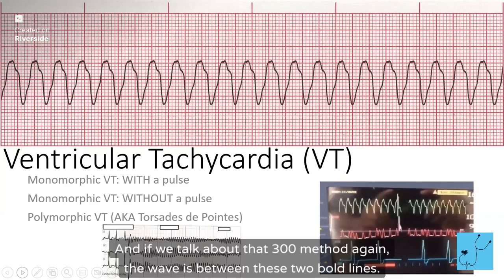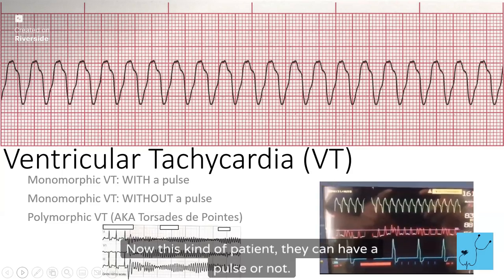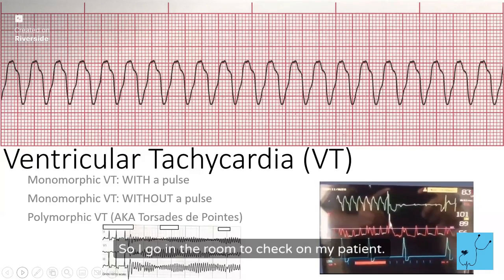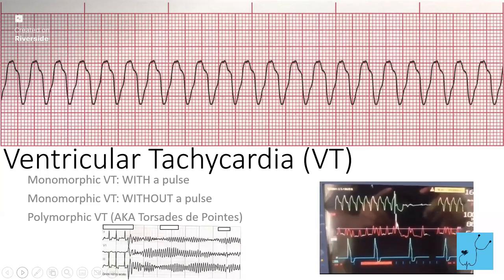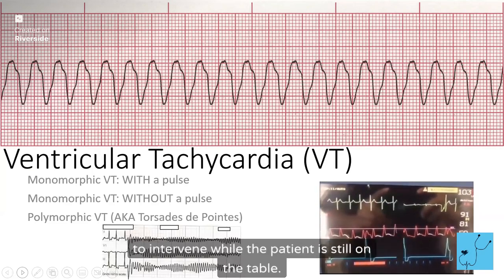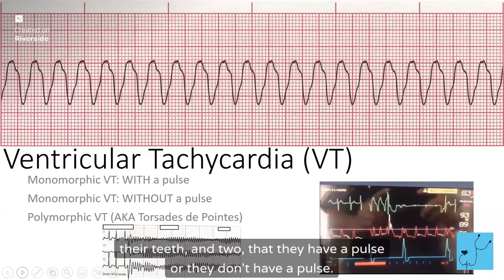And if we talk about that 300 method again, the wave is between these two bold lines, so it's going at least 300. Now this kind of patient can have a pulse or not. I've had patients that go into this. I go in the room to check on my patient, and on the inside I'm ready to code this person, and they're just sitting there watching TV and they're like, what? So it tells me we have a very short amount of time to intervene while the patient is still okay. It's important that the nurse checks, one, that they're not brushing their teeth, and two, whether they have a pulse or don't have a pulse.